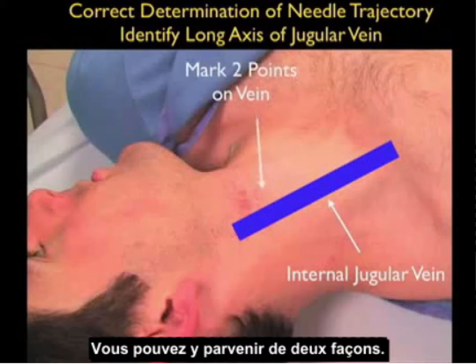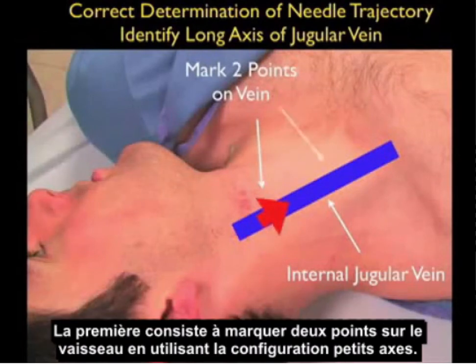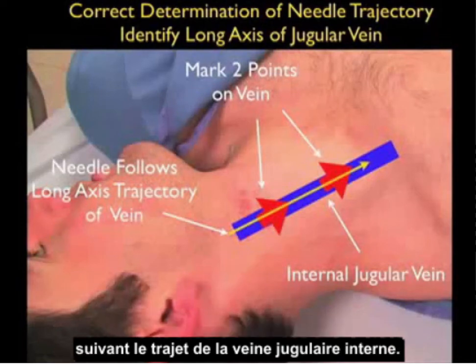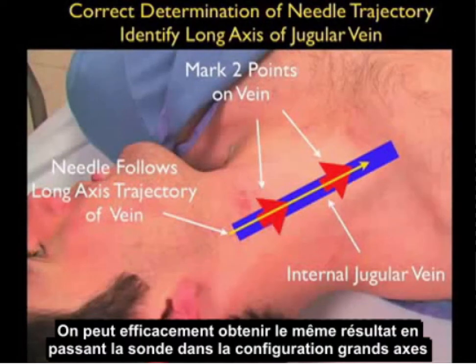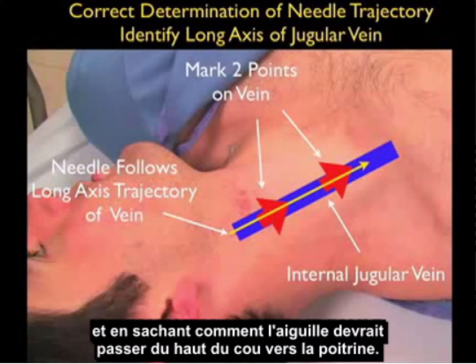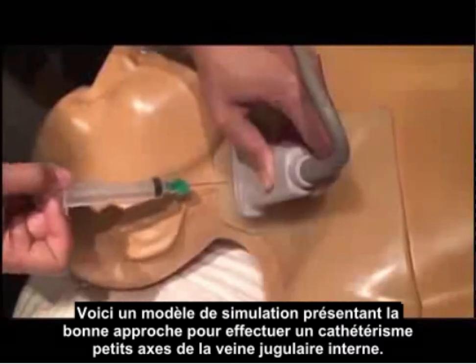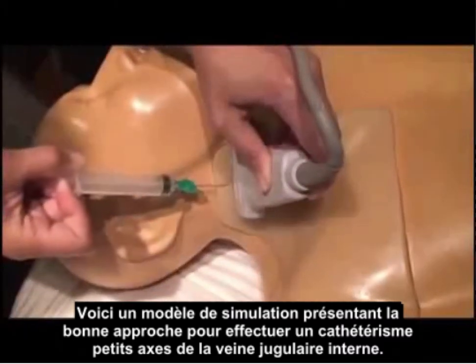The solution to avoiding this pitfall is to know the course of the vessel as it runs up and down the neck. We can do this in two ways: the first is to mark two points on the vessel using the short axis configuration. The needle would then enter at that distal mark and aim towards the proximal mark, passing along the course of the internal jugular vein. We can effectively do the same thing by passing the probe in the long axis configuration and knowing how the needle should pass from the top of the neck down towards the chest. Here we use a simulation model to show the correct approach for a short axis cannulation of the internal jugular vein.